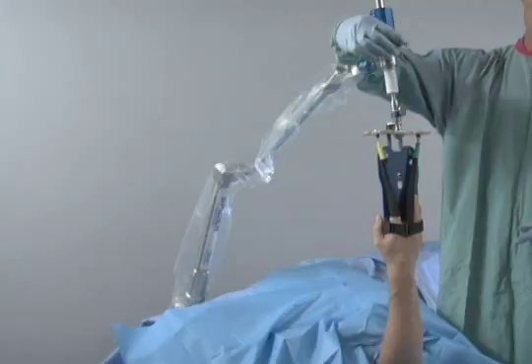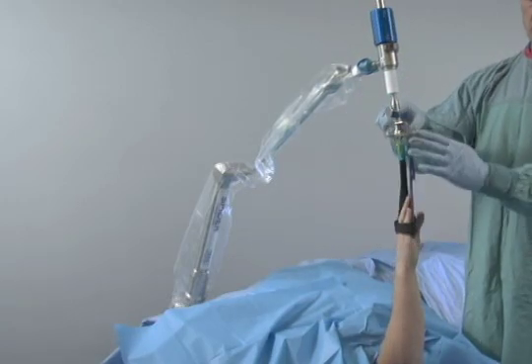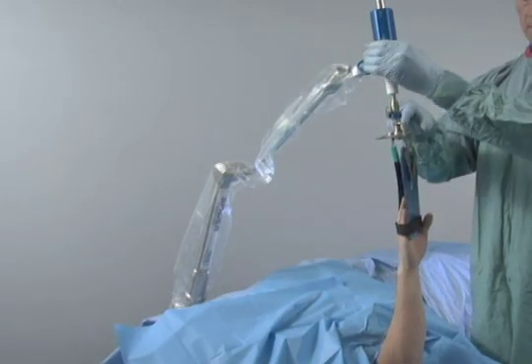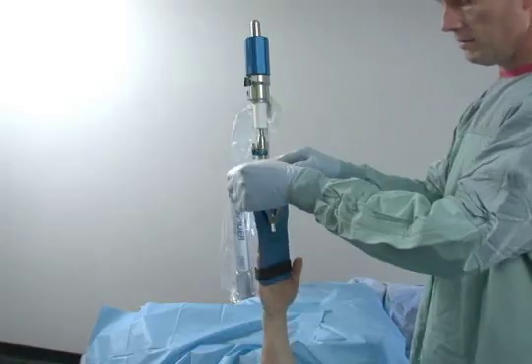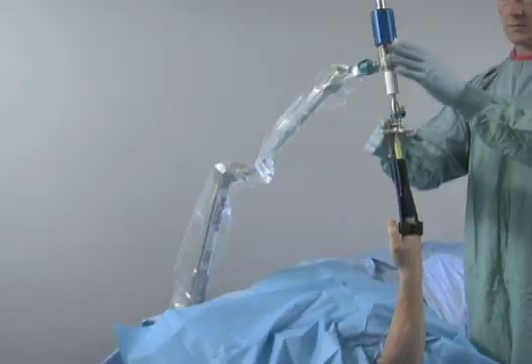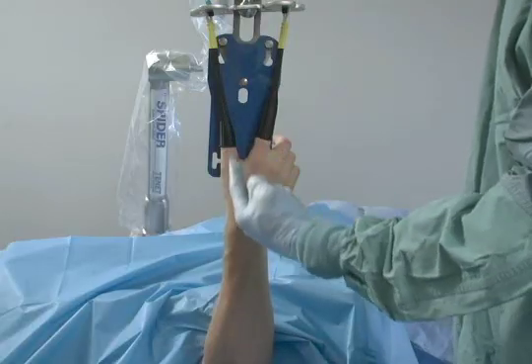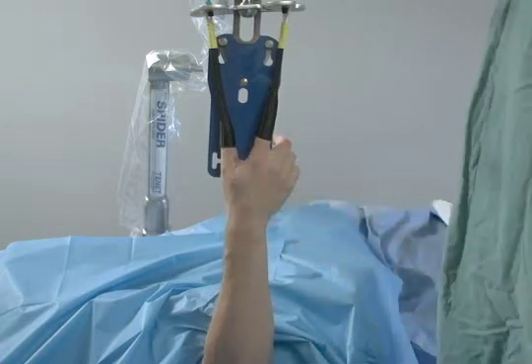Pronation and supination can be adjusted by releasing the rotation cam and turning the patient's wrist to the desired position. The position can again be locked in place by locking the cam. Intraoperative adjustments are very simple, and the wrist can be held in a rigid position. The arm can be held in a full range of pronation and supination without ever changing the amount of traction on the limb.